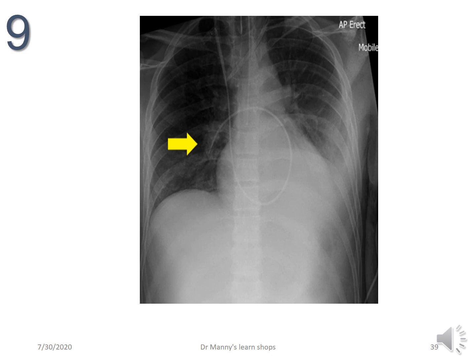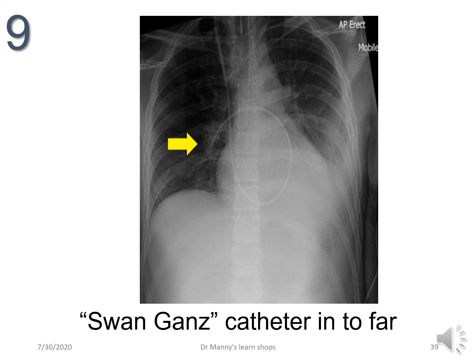Okay, here's a chest x-ray that's highlighting a pulmonary artery catheter. And the pulmonary artery catheter, is it in the right position? What do you think? Is it in too far, or is it in not far enough? We said 1 centimetre before or after the sternal midline. This catheter is in too far. It's incorrect placement and potentially dangerous.